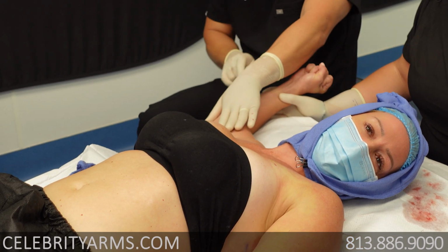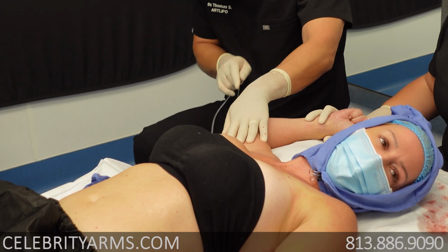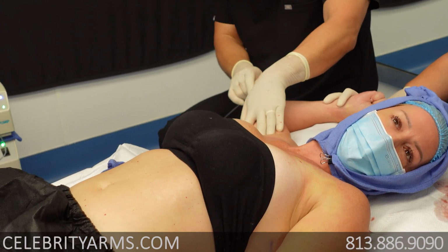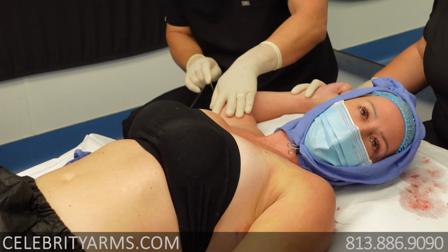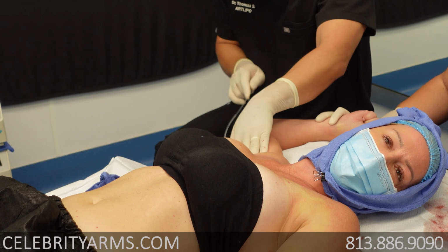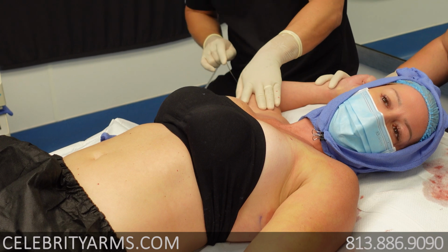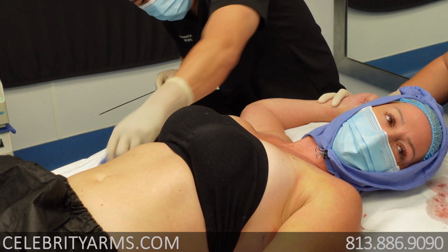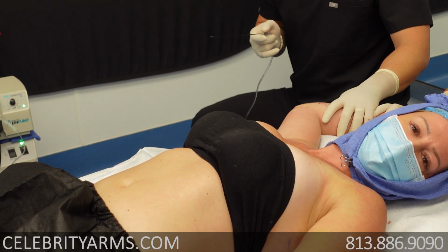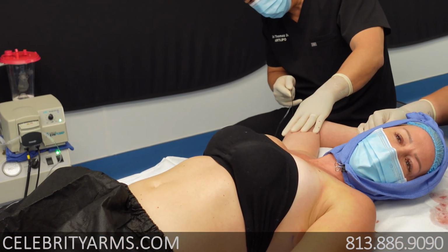And the more that you're numbing, the less that I'm feeling. Correct. A little bit of warmth, very little bit of warmth. If I would have to say areas that might be more sensitive is maybe as you get closer to the axilla, but again, it's not uncomfortable. It's very tolerable. So I usually tell patients it's a weird sensation, right? It's a very strange feeling, right? I guess it's strange, but there's no pain to it.